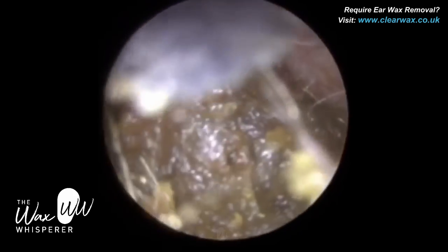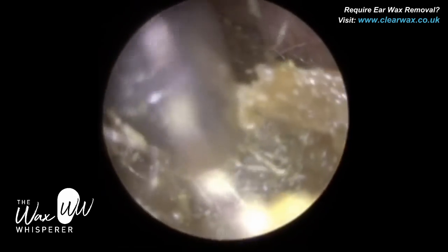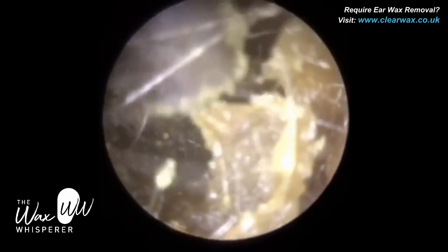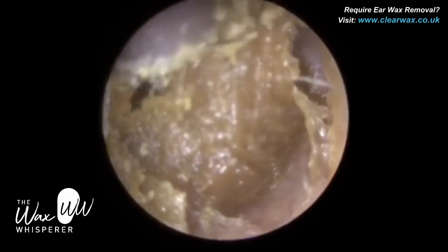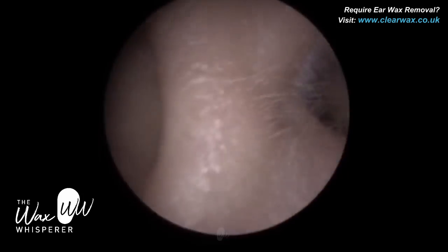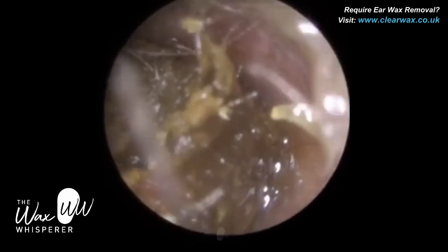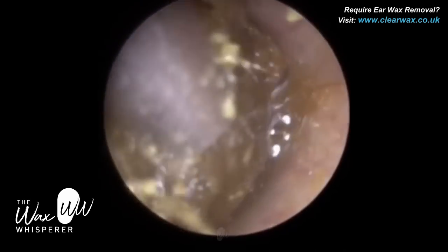We're not using any local anaesthesia here, so for me it's so important to make sure the patient is as comfortable as possible. You can see this keratin — this dead skin that's enveloped and engulfed itself around the plug of wax. I've just put some olive oil drops in — not too much, just enough to lubricate the base of the ear canal and loosen this keratin.